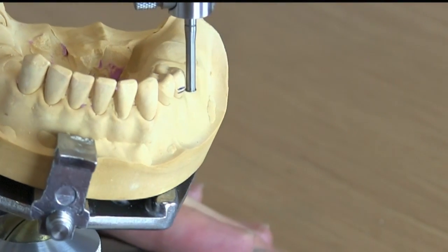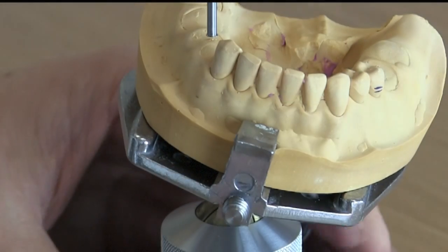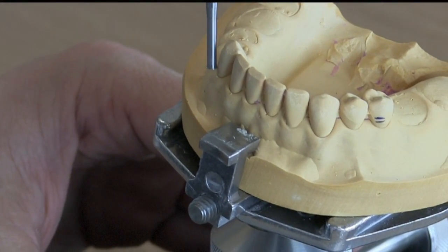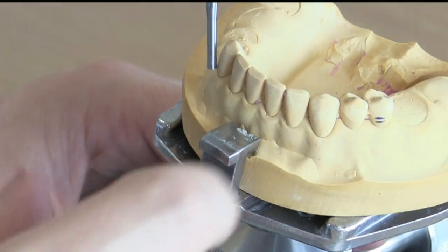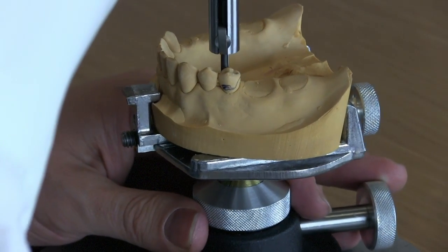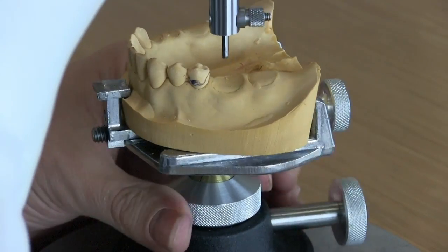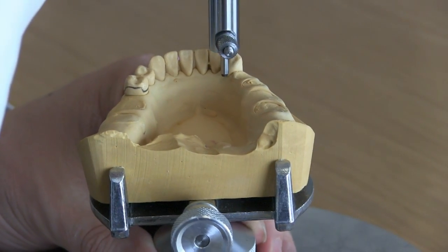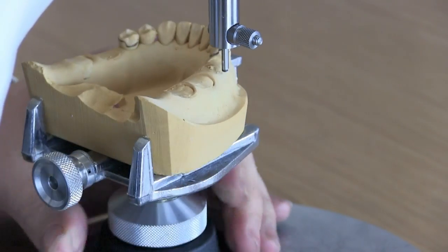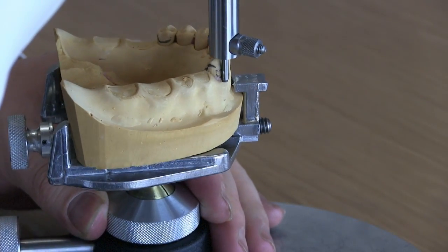However, what commonly is the case on these lower anteriors is that by tipping, it means that the already bad canine is now in a worse spot — not always. Sometimes you can change the table to help both of them align. So how do I get around this? First, we talked about table tilting. This is the current table tilt height of contour. We'll trace both the guide planes just to give us an idea — look how high that is, I've got tons of room to play here. Almost to the top of the tooth. If I tip that table forward, it'll deepen the undercut on the other surface.